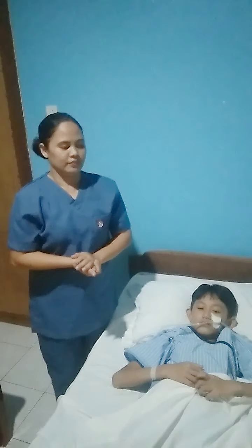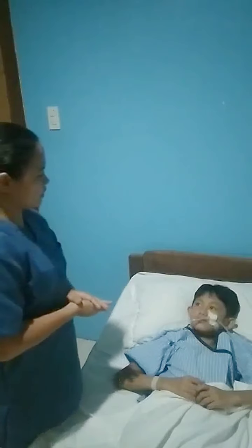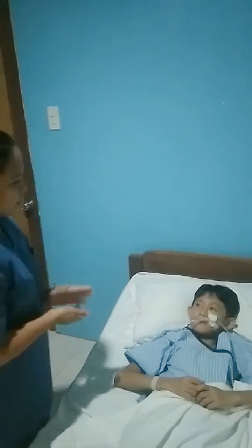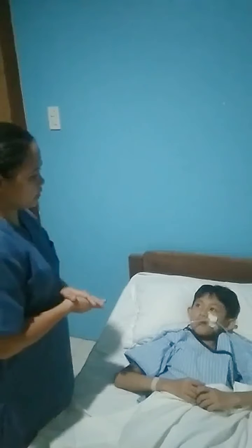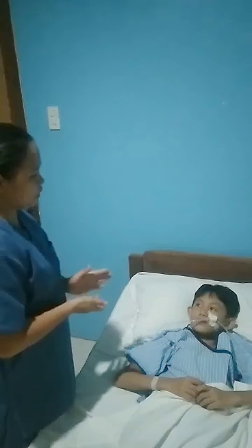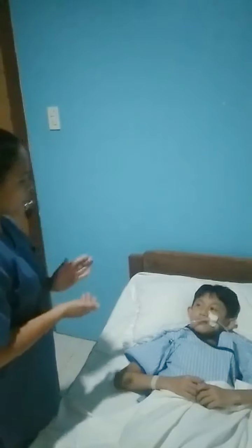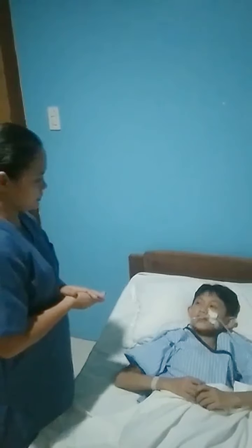Next is to explain the procedure to the patient. Let the patient know that it will be a little bit uncomfortable, but it will be over quickly. Sir Ryan, today our doctor has ordered the removal of your nasogastric tube. Since you have recovered and may now be allowed to swallow food using your mouth, it will be a little bit uncomfortable, but it will be over quickly. So, taking a breath and relaxing yourself will greatly help. Okay? Good.